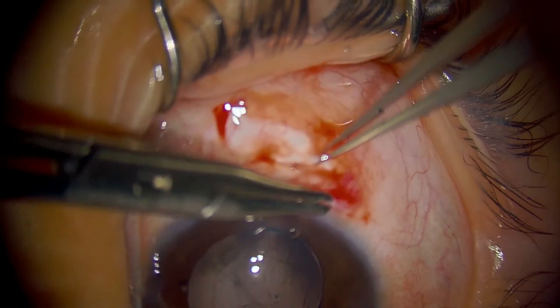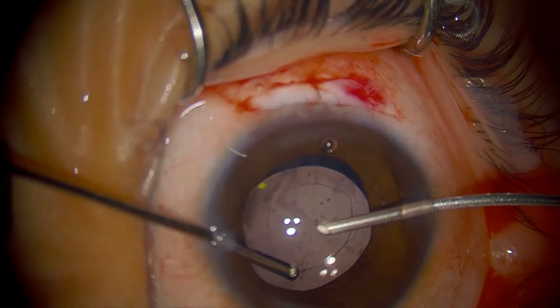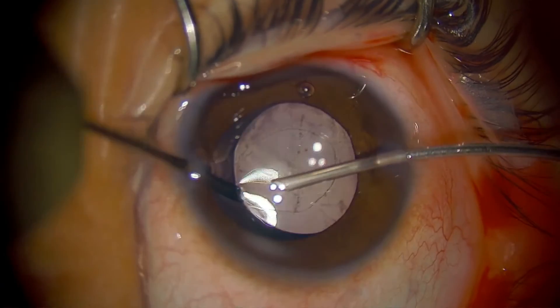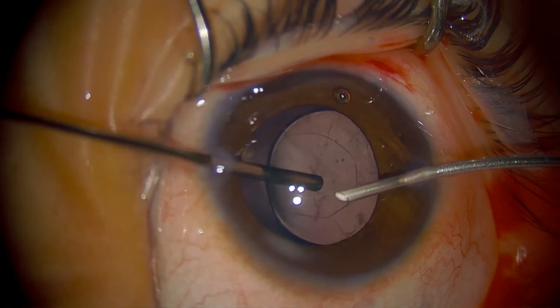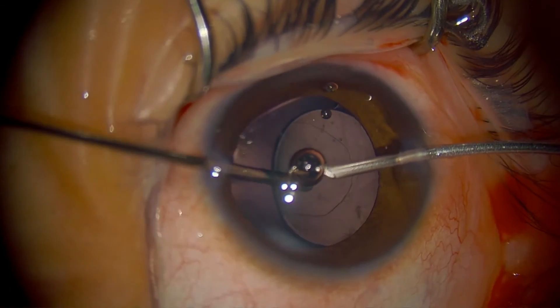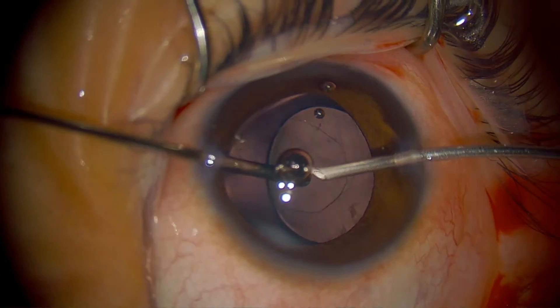Here I'm just closing this incision site. The idea for the anterior vitrectomy is to cut the posterior capsule and at the same time do a core vitrectomy to break the anterior hyaloid, so there's no scaffolding for those lens particles to regrow. The way we do it is to put the viscoelastic in the front — I'm going to go around the lens and behind it, enlarging my posterior capsule opening.